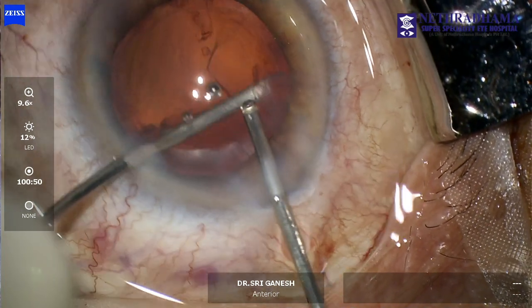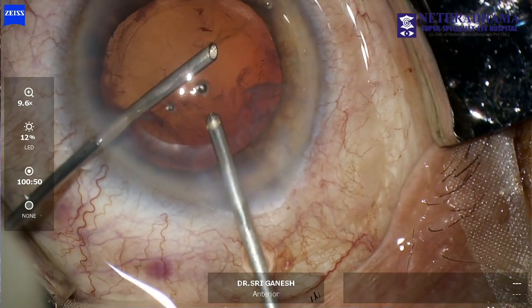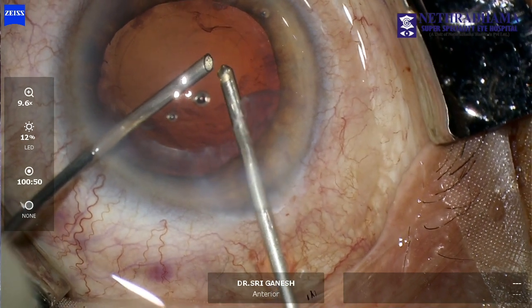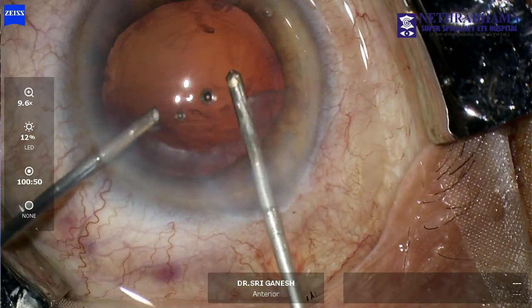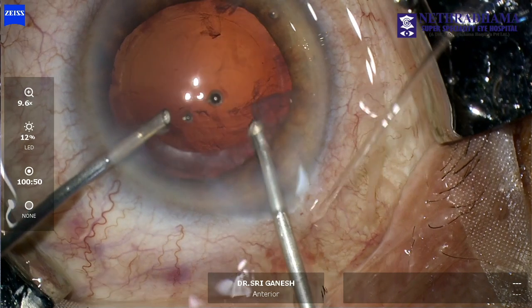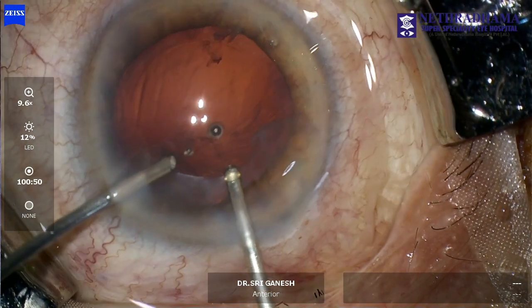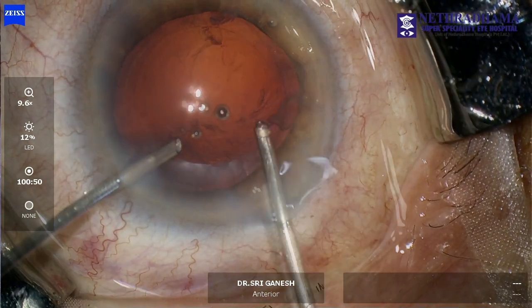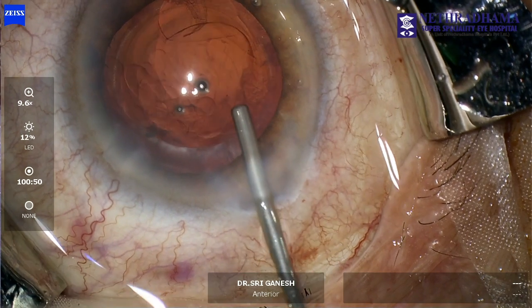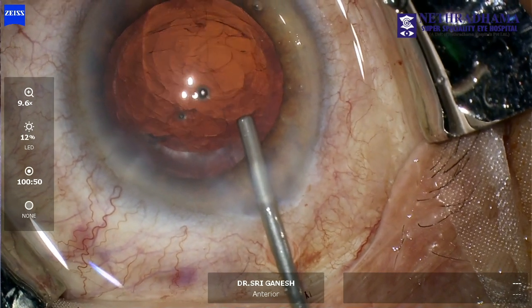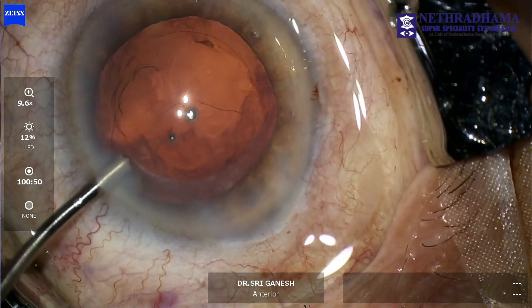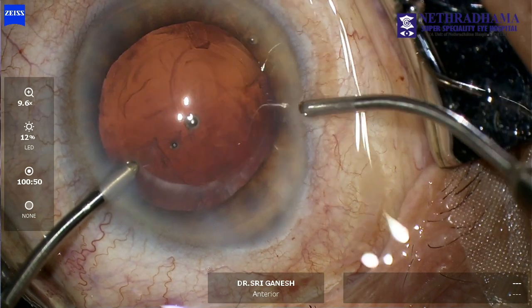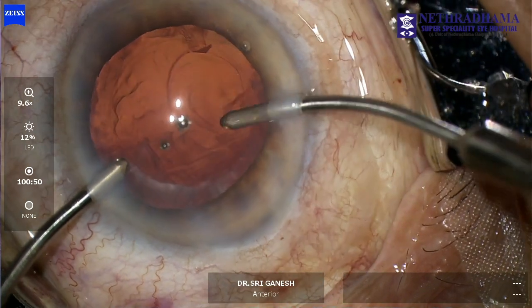You can also use triamcinolone if you are not able to visualize the vitreous strands. But here we are able to make out the distortion in the capsulotomy, which is an indirect method to assess if there is vitreous in the AC. Following that, I switch over to a bimanual IA.